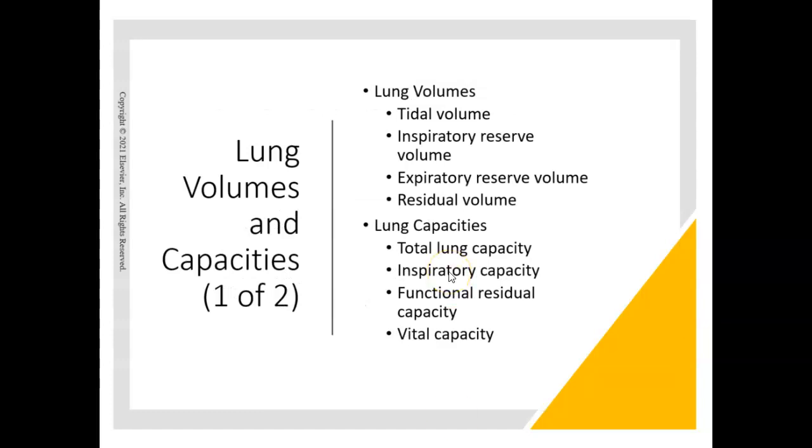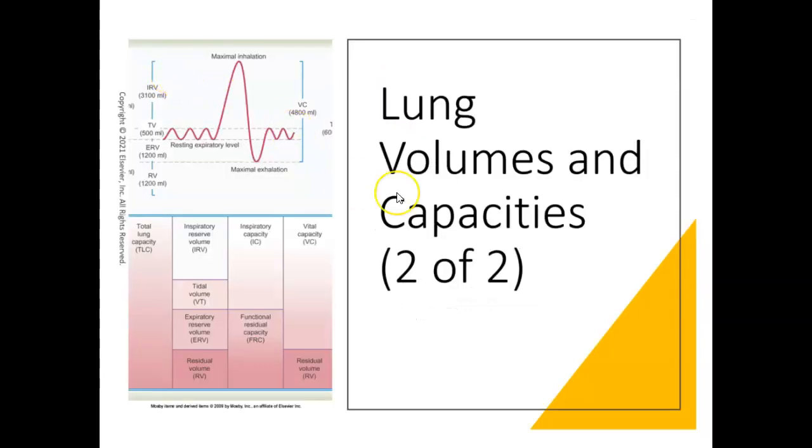Lung volumes and capacities. All right. So typically, and I would have laid this book out differently, I guess, when I have a patient that comes in for a complete PFT, the first test that I'm going to do is usually my lung volumes test. Even though spirometry is the most common, I usually start with my lung volumes. So if I do my order of operations here, I'll do lung volumes first, which is a slow vital capacity plus plethysmography.